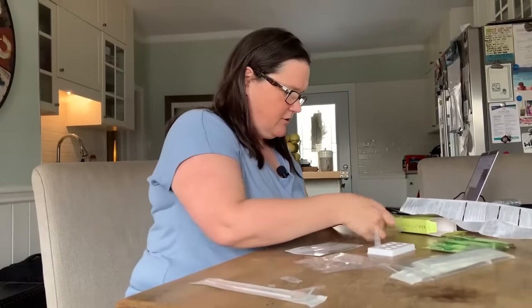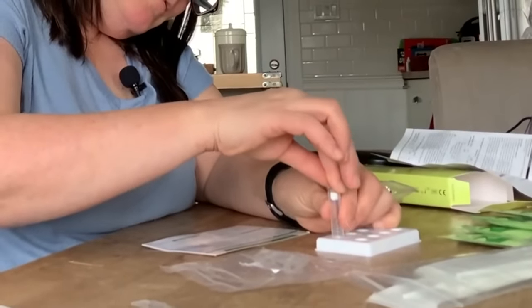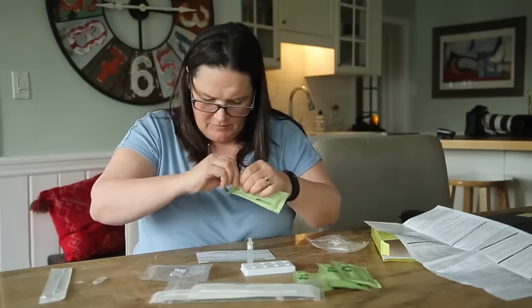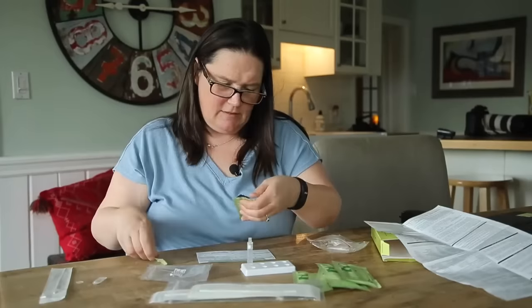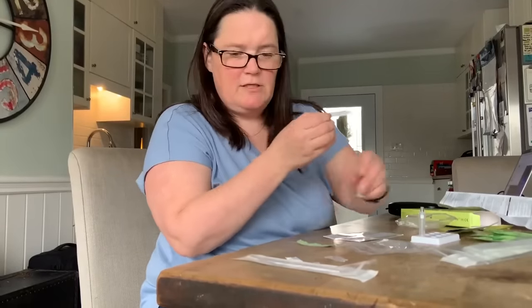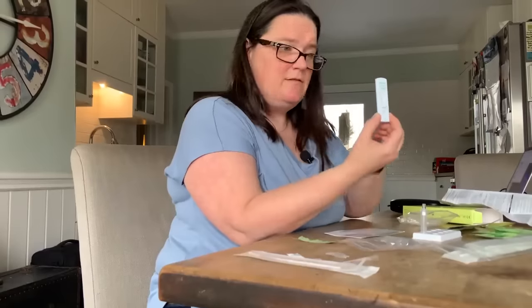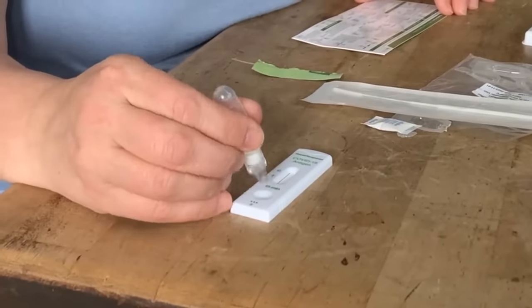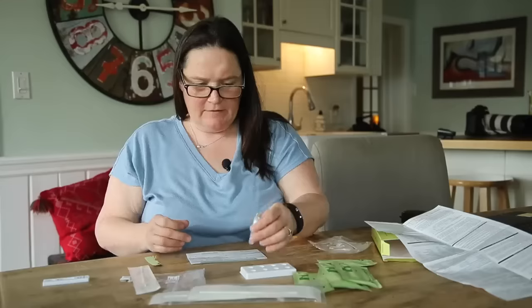Now attach the nozzle to the extraction tube. There are two sides to this, so you want to have the thick end down. There's a little filter in there. Invert the tube and add three drops of the extracted solution into the sample well of the test device. Here is the test device — we have C and T. One, two, three drops. It's going down in there.